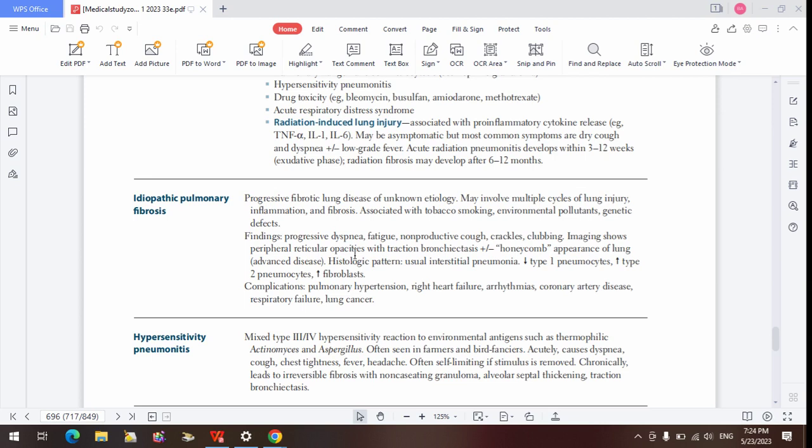And because you can have patchy fibrosis in the area, those fibrotic areas are going to create cystic spaces within the parenchyma. So that's what brings about the honeycomb appearance of the lung parenchyma. You tend to see that in advanced cases of pulmonary fibrosis. Cystic spaces that are more than like 3 millimeters, surrounding fibrotic areas. That is what represents the honeycomb appearance of the lung. You can see it on the X-ray, you can see it with your CT scan.